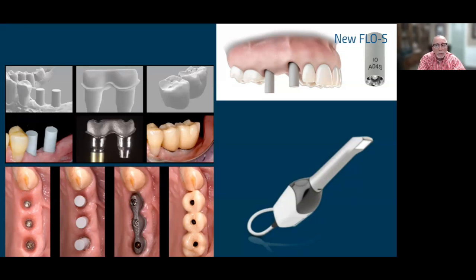This is a scan post that actually allows you, the dentist, to put 3, 4, 6, 8 of them in the mouth, scan it, and send that data to the lab. It has to go through the lab, and the lab has to do a scan upload. It's a pretty big file movement thing. But anyway, because the data is so good, the substructure for the bridge can be 3D printed. It's actually called selective laser melting. Pretty fantastic piece of equipment.